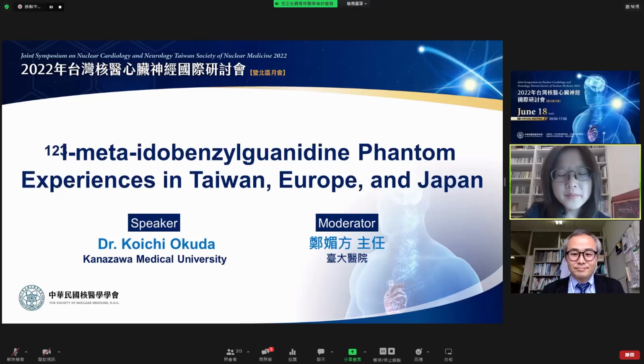Okay. I was just wondering, the standardized uptake value, I understand that some SPECT cameras can actually provide this kind of value, SUV like PET. So does that mean that the SUV value will also vary between different cameras if we use SPECT technology to do the quantification?